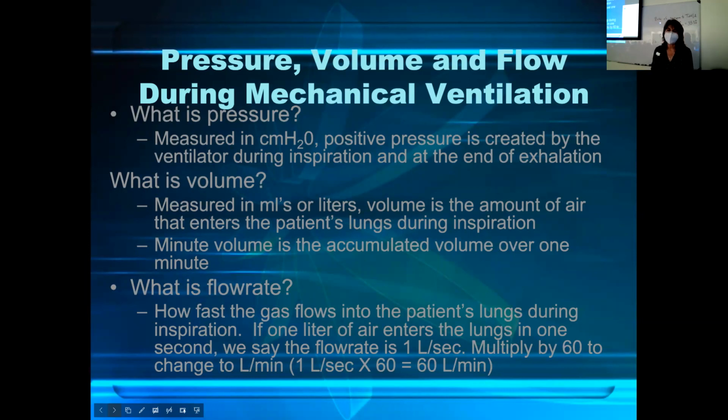So for flow rate, it's how fast we're pushing the air into the lungs. So you could take 1 second to push the air in, or you could take 2 seconds to push the air in. That would be flow rate. And then how much volume over a minute? That would be minute volume.